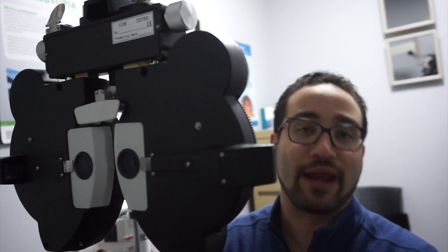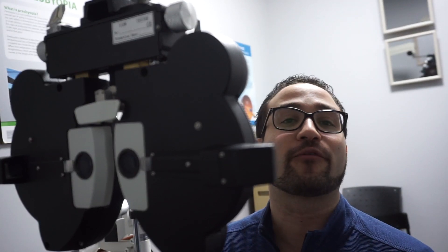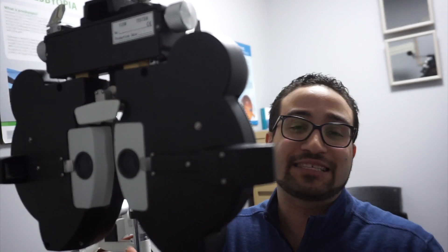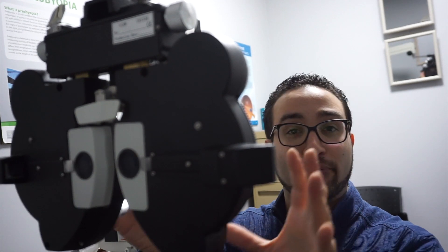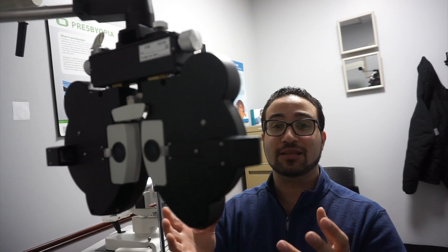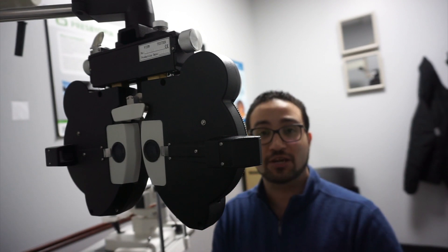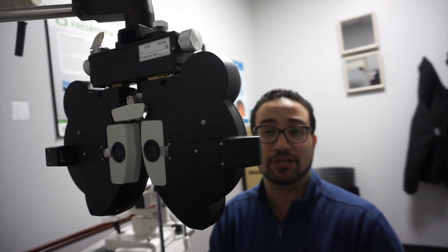Once we're set up, we can start what we call retinoscopy — that will be covered in a separate video. Some offices also use what we call an auto refractor, which gives you similar values to retinoscopy, essentially a starting point for the prescription that you can preset into the phoropter. Now that we have the patient aligned, the machine aligned, and a preset prescription — based on autorefraction, retinoscopy, or previous glasses — we're ready to begin.